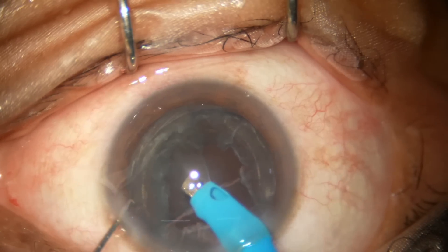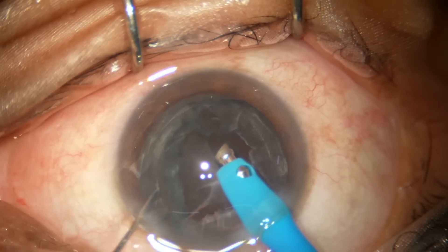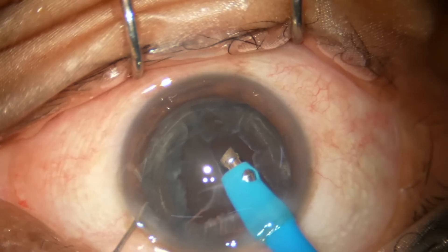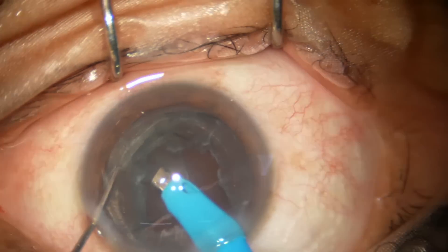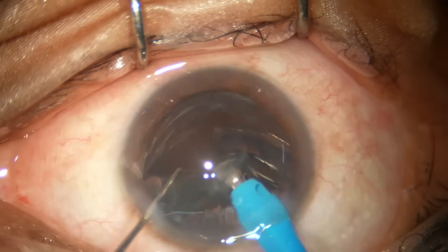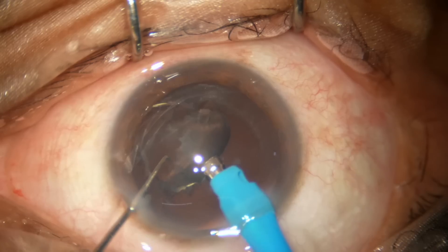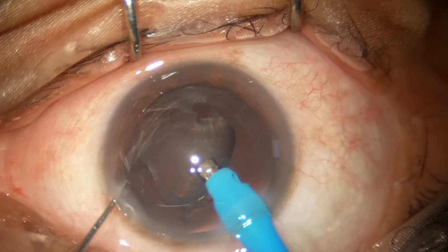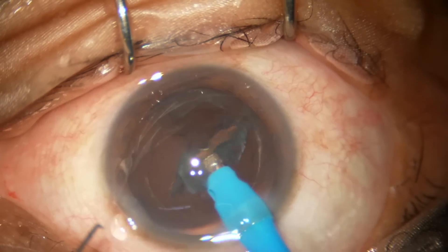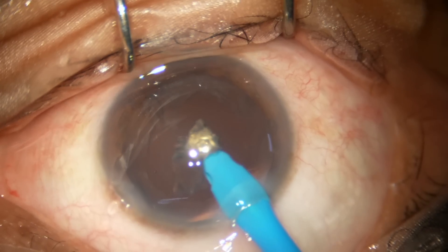Now the epinucleus. I decrease the vacuum. I hold the epinucleus, bring it to center, and emulsify the epinucleus. For the last part of the epinucleus I will use only 90 vacuum.